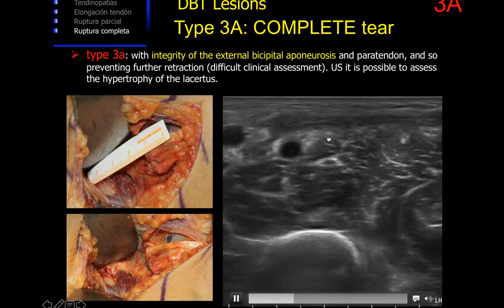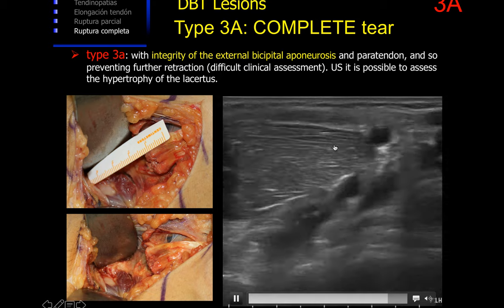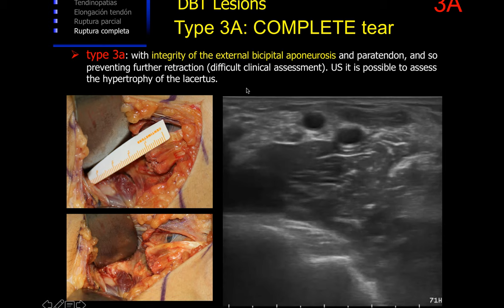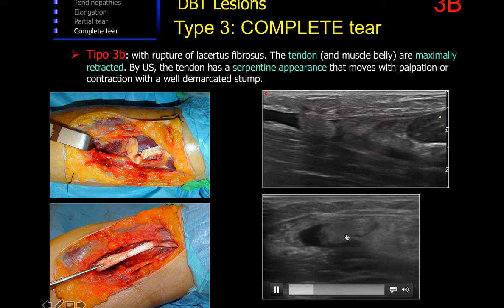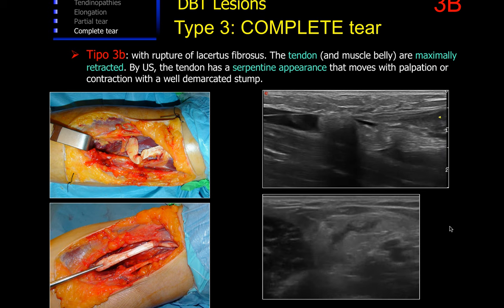In the short axis, we can clearly show the amount of retraction — in this case a retraction of only 4 cm in a complete tear. Complete tears associated with lacertus fibrosus tears are the most retracted, generally over 8 cm. We classified this type of tears as Type 3b ruptures. On ultrasound, the tendon has a serpentine appearance, moves with palpation and compression, and also with contraction of the muscle, with a clearly well-demarcated stump.